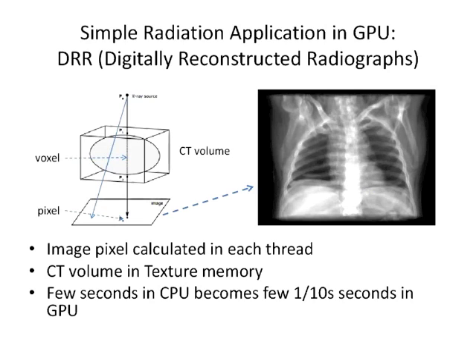Okay, so let's look at the simple application that we tried 2 years ago, using GPU or MPI. Here, just the GPU side. One of the applications we frequently use in the radiation department is more like X-rays, but applied on the CT.